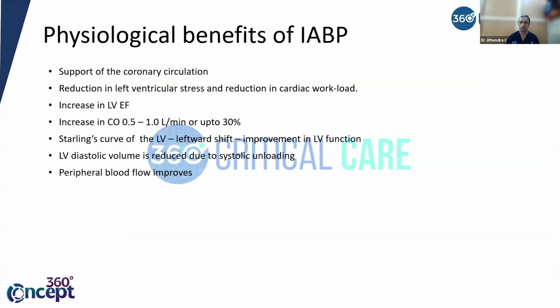So now coming to the physiology. We saw the hardware part, how to time it, how to trigger it, how to augment it, how to wean off, all those technical terms. Now coming to the physiological benefits.